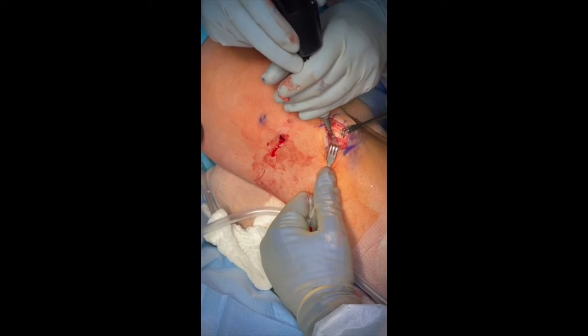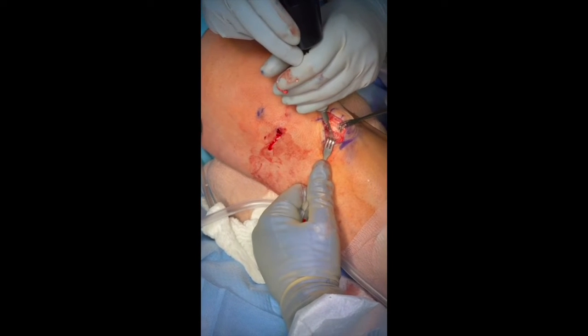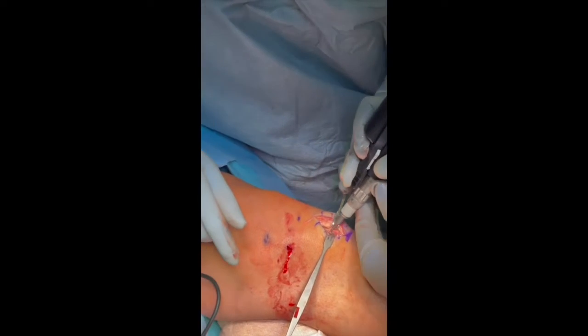A 1.5cm x 2cm Osgood-Schlatter ossicle is removed. A high-speed burr is used to create a good bed of bleeding bone at the proximal aspect of the tibial tubercle for repair of the tendon.